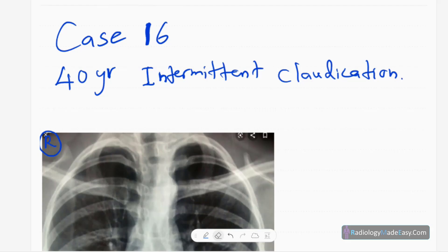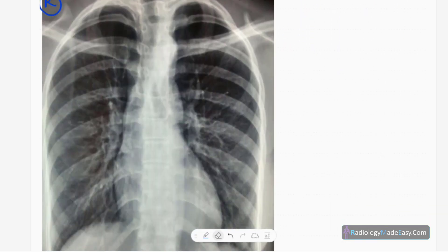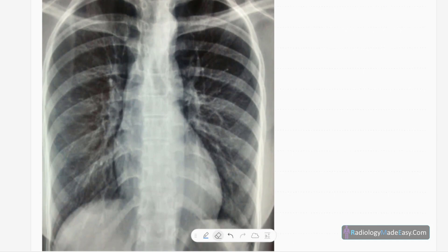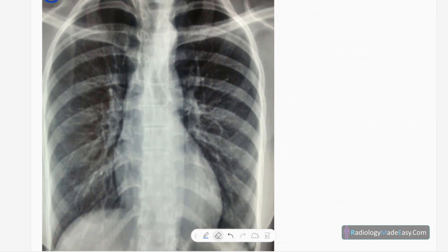Hello everyone, this is case number 16 of the RS series in radiology. Today our case is a 40-year-old patient presented with intermittent claudication. This is the frontal chest radiograph of the patient.